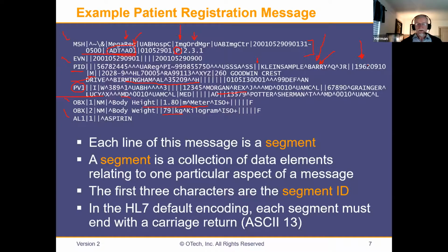Right, so simple, right? ASCII text based, and you see how compact it is. And so that's why we can have tens of thousands, literally, of these small messages going back and forth through the hospital. Sometimes we group these messages together. We call it batch mode, right? For example, at the end of the day, we might send a list of all the orders for supplies and PPP and whatever we need back to a big provider, maybe McKesson or somebody else.